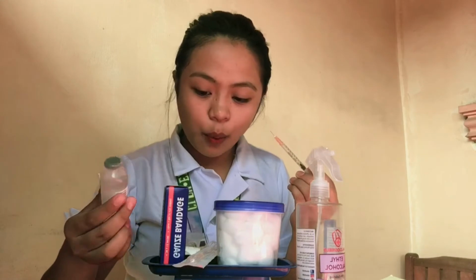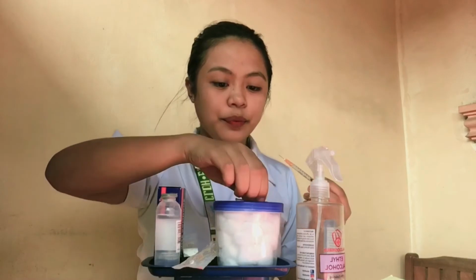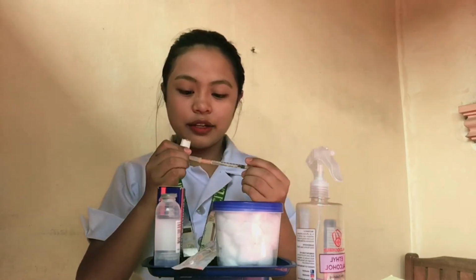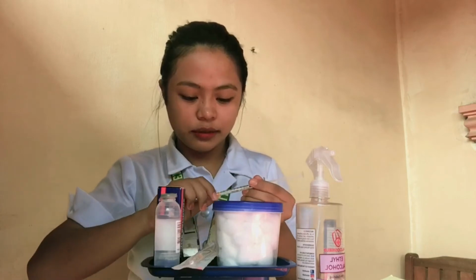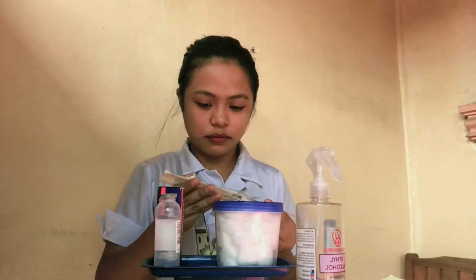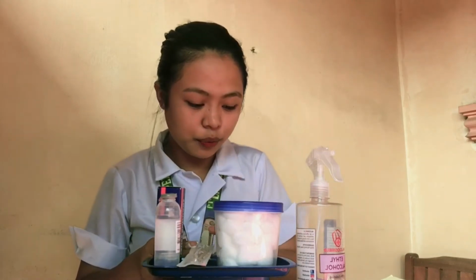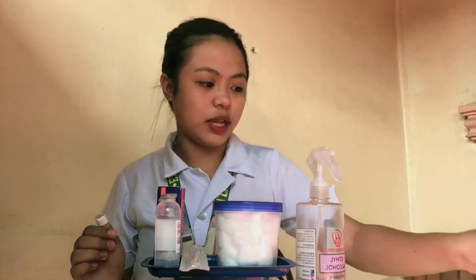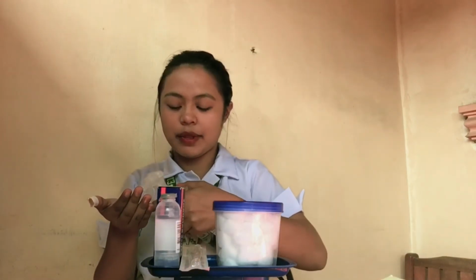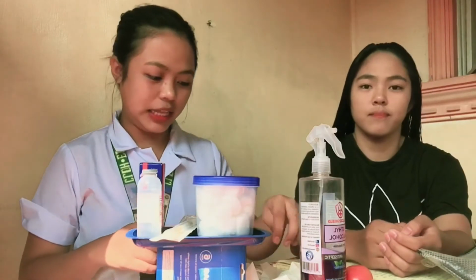So after getting 1 ml of our sterile water, we need to remove the aspirating needle and replace it with the original needle. After that, we need to dispose of our aspirating needle in its right disposal and perform hand hygiene after getting the medication. After performing hand hygiene, we will now wear our clean gloves.